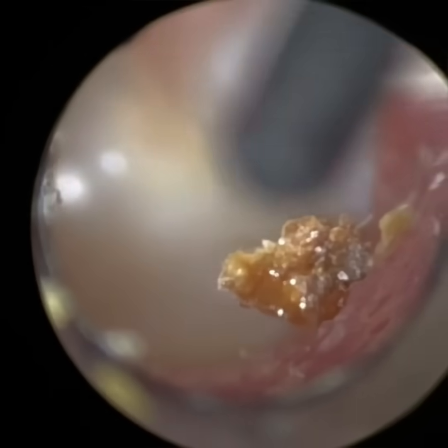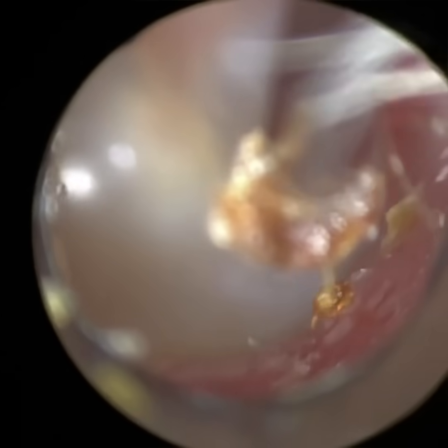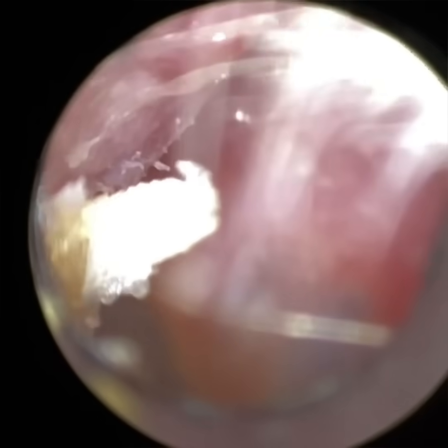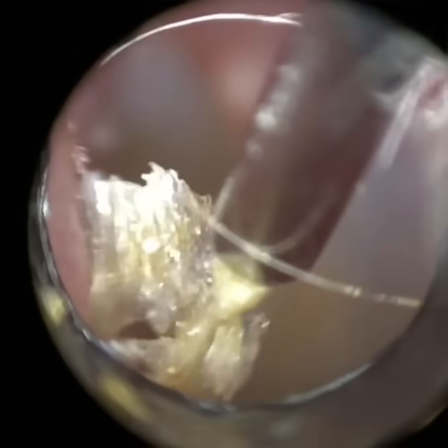With the WAXscope, it's mainly focus driven. So you can see I've got this piece of skin deep in the ear in focus, and so I know I've got the depth. So it works differently. So don't let anyone say that you can't get depth perception using monocular cues.